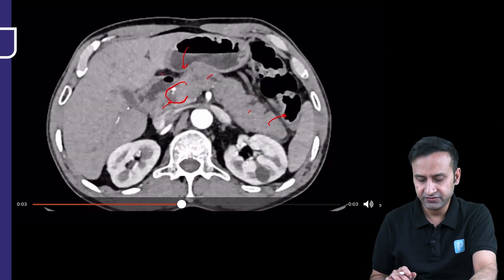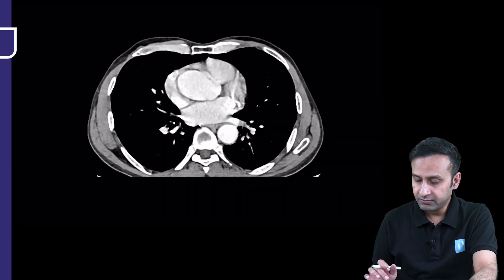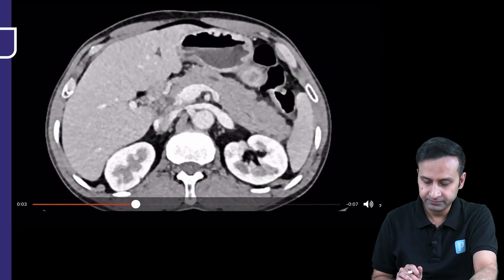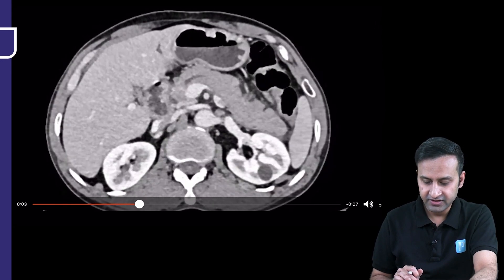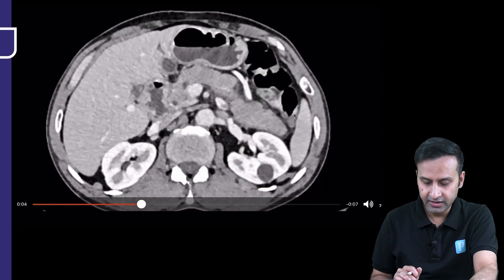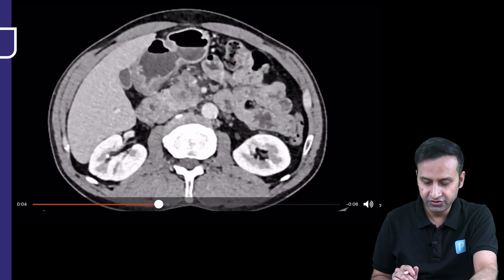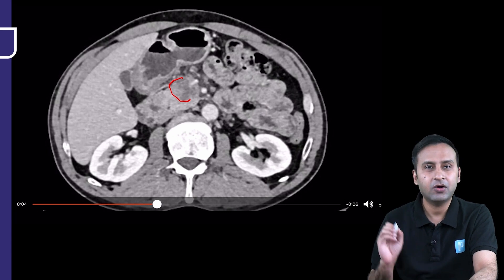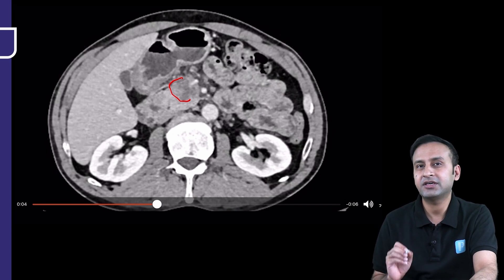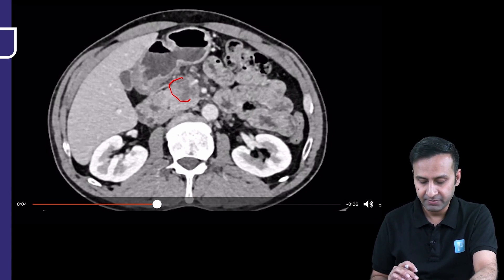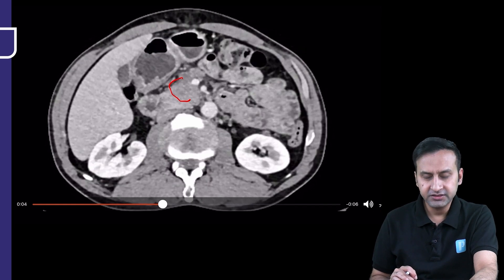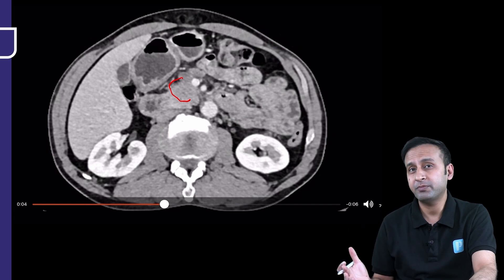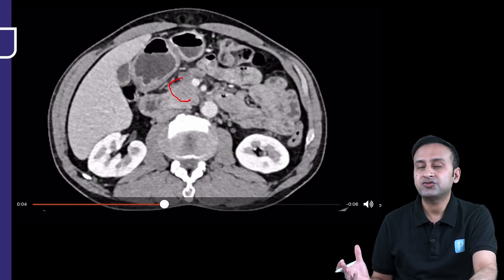Let's look at the venous phase now. Scrolling from top to bottom, we can see the pancreas is enhancing quite well, and the main pancreatic duct is dilated up to the region of that irregular hypo-enhancing lesion. It's now clear we're dealing with a mass in the region of the pancreatic head. Why can't it be pancreatitis? Many times local pancreatitis can also behave this way, but mass-forming pancreatitis is different from pancreatic adenocarcinoma in two major aspects.